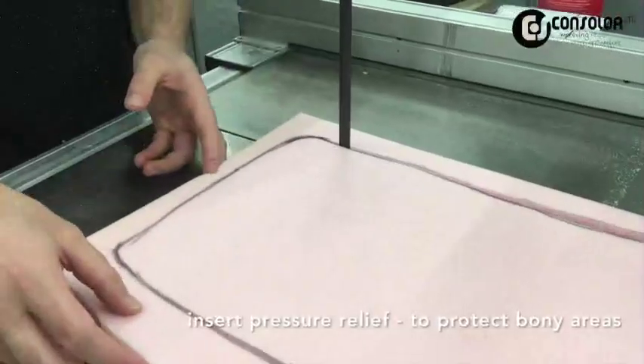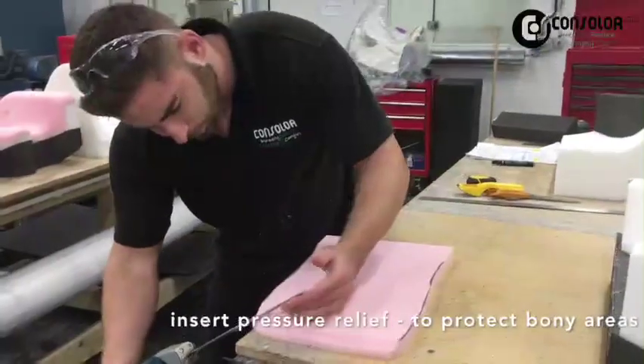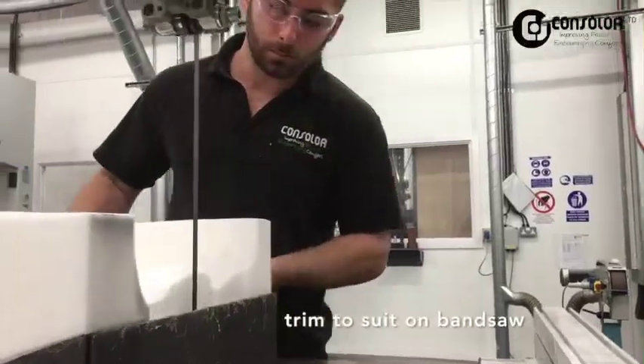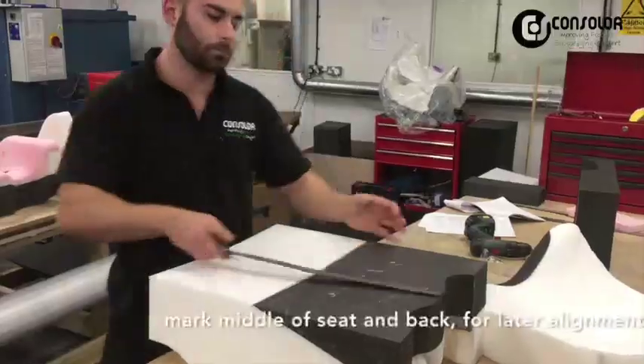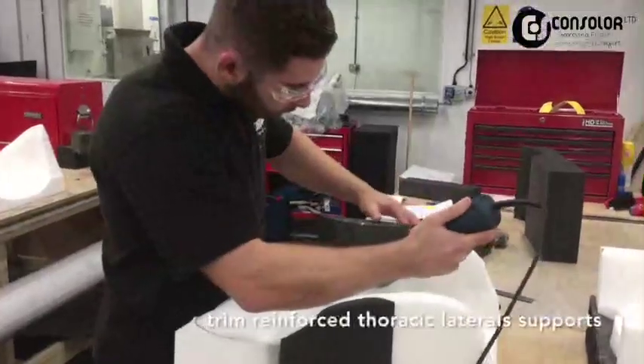The cushions are finished by hand in the machine workshop. This involves adding firmer foam for extra support and visco-elastic foam in areas at risk of increased pressure, such as the base of the spine and under the pelvis. This also improves comfort and pressure relief.